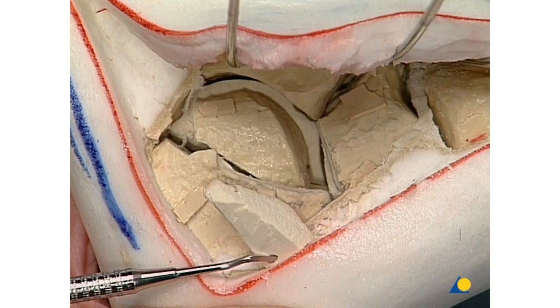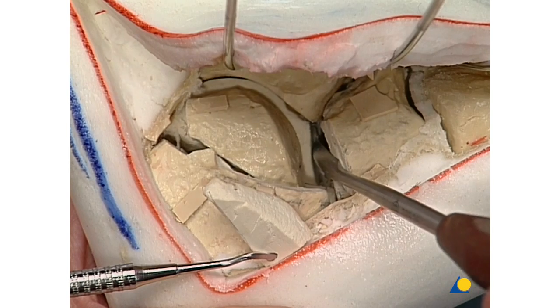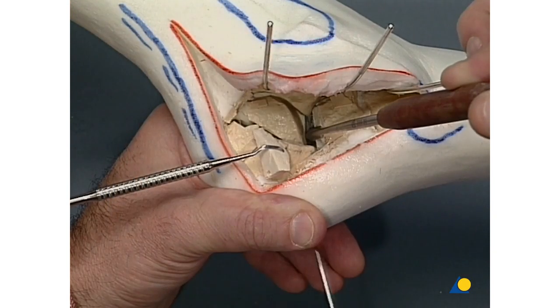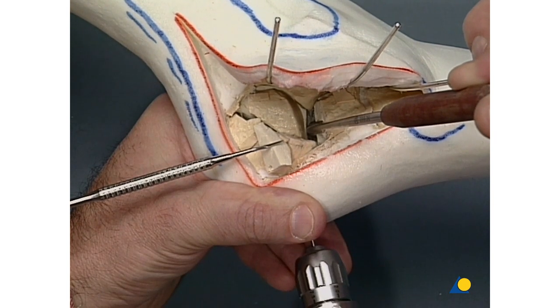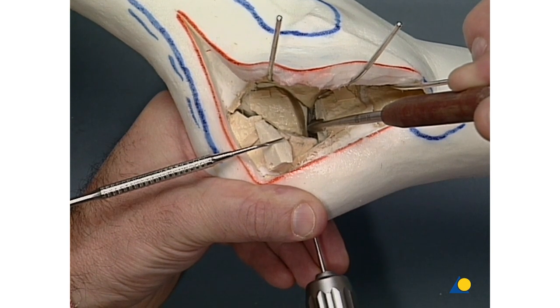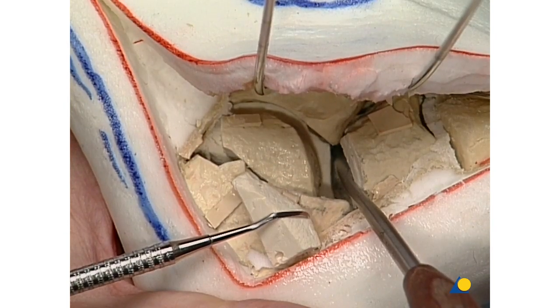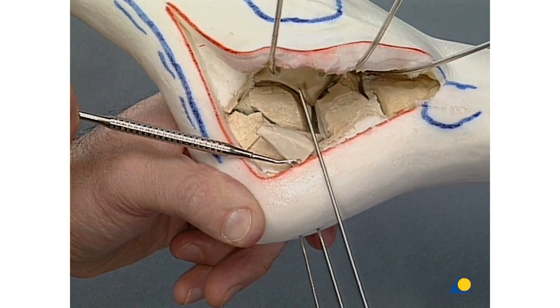We begin with the reduction of the posterior portion of the joint from medial to lateral. The medial fragment is reduced onto the articular surface of the talus and temporarily fixed to the talus with two 1.6-millimeter K-wires. By removing the periosteal elevator, we make sure that the K-wires have a good hold in the body of the talus.